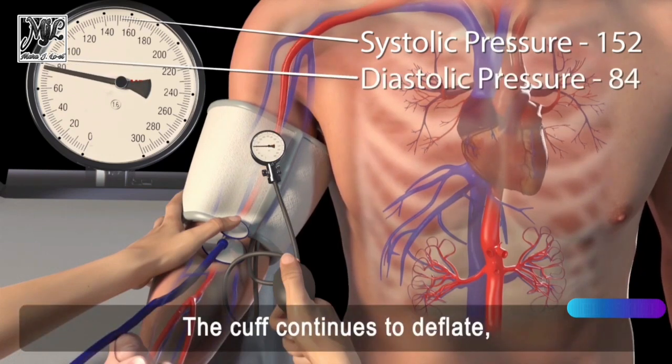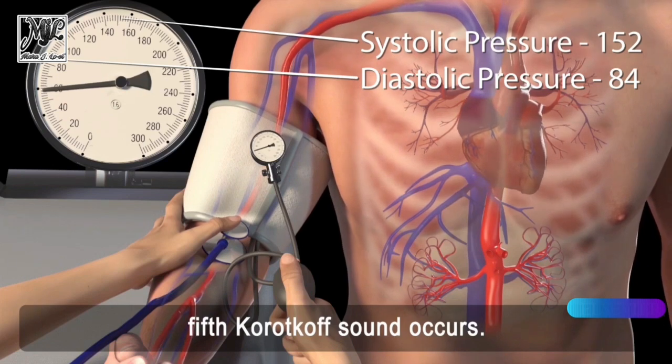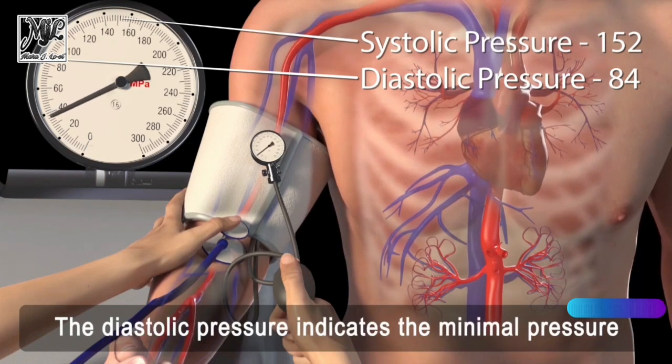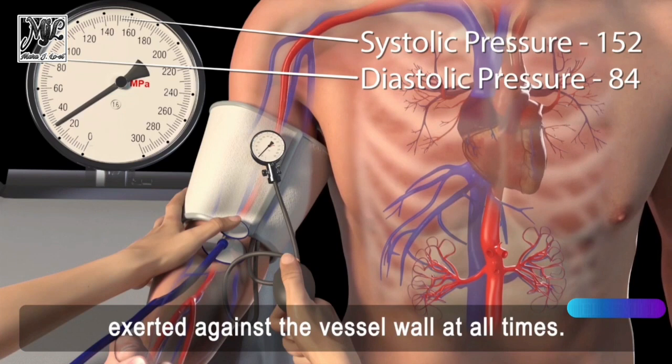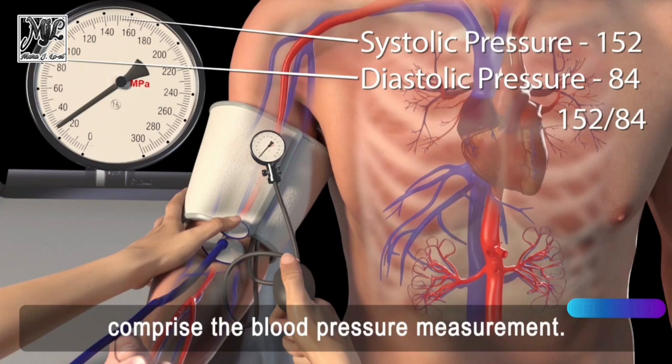The cuff continues to deflate and the tapping sound disappears as the fifth Korotkoff sound occurs. This final sound is considered the diastolic pressure, which indicates the minimal pressure exerted against the vessel wall at all times. The combination of the systolic and diastolic pressures comprise the blood pressure measurement.